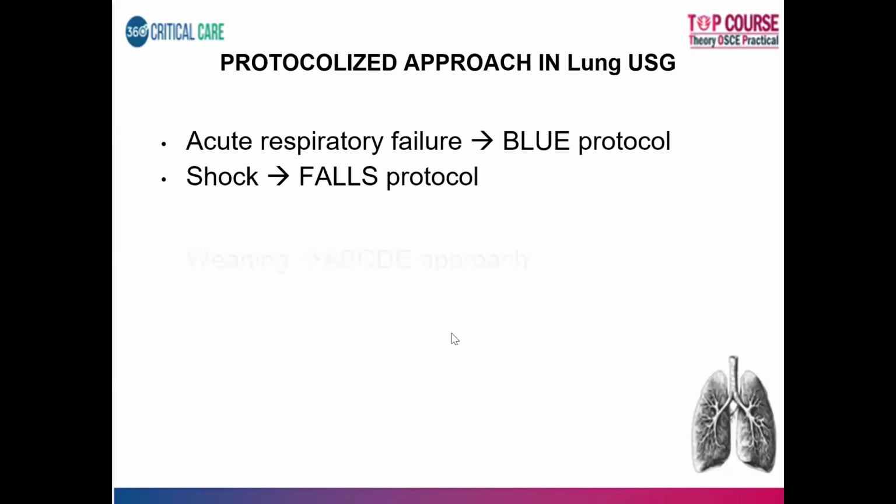We'll be able to identify the pathology at the earliest. In weaning, we use another protocol called the ABCDE approach. That is going to combine both the echo as well as the lung ultrasound, which I'll be dealing with in the last part of the talk on lung ultrasound.